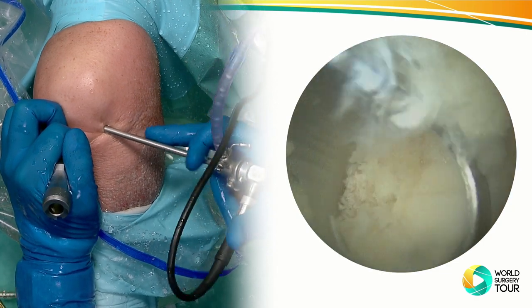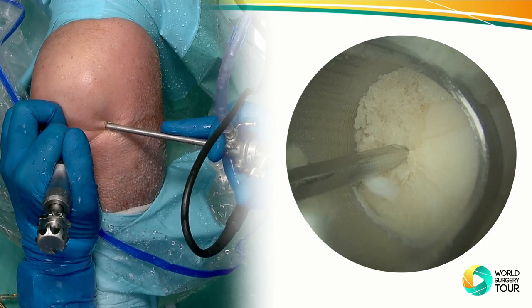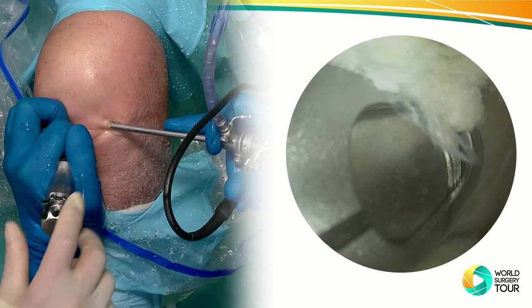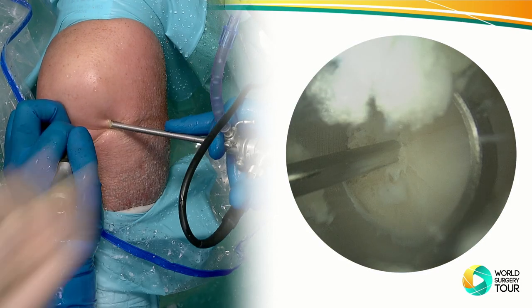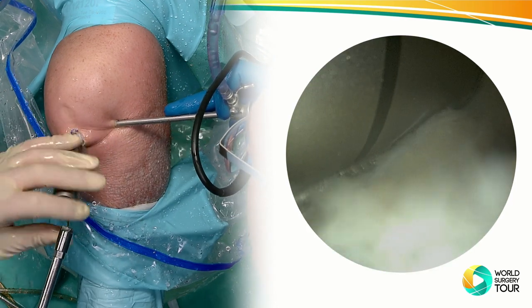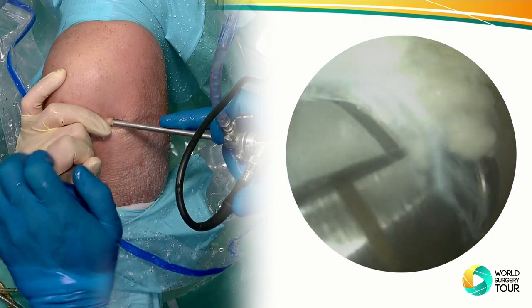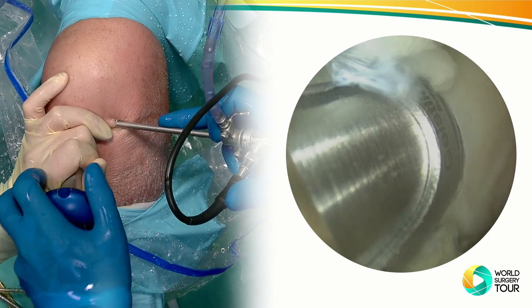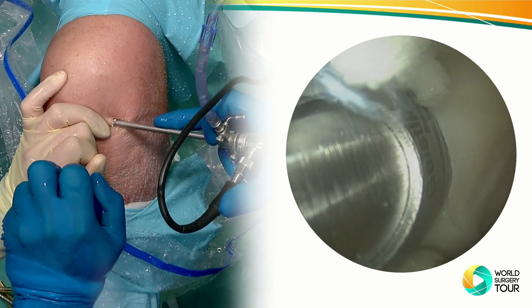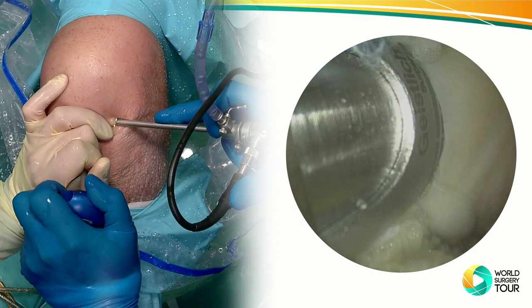Good. Then the centralizer again. So you see, we're in the same position. Then take it out, okay. And we continue with the reaming of the defect. Okay, let's fill it in again. Perfectly aligned, looks nice. You should apply a firm pressure so that you don't tilt the cannula. Otherwise, as happened before, it loses its position. But if you just apply gentle pressure in the axis, then that should be no problem.